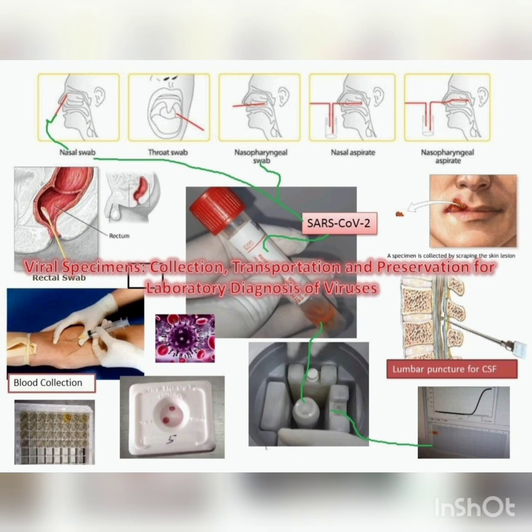The fourth point is that the specimen should be of sufficient quantity, meaning not too much, which is waste, and not too little, which is not enough to carry out the diagnosis. For that purpose, in a sterile container you need to collect a sufficient quantity of material for investigation, whether it is sputum, urine or stool.